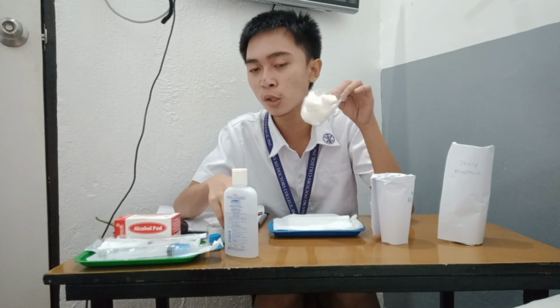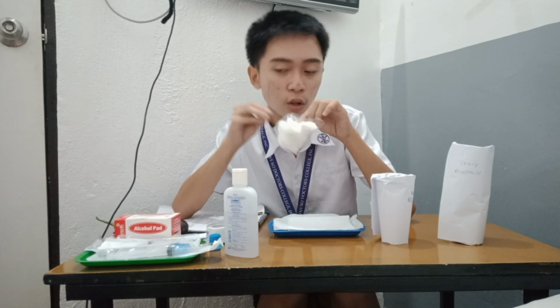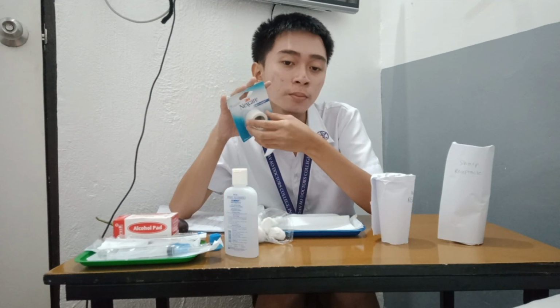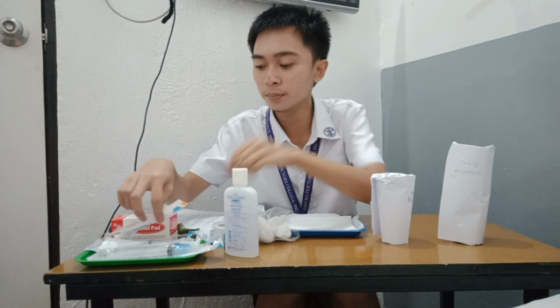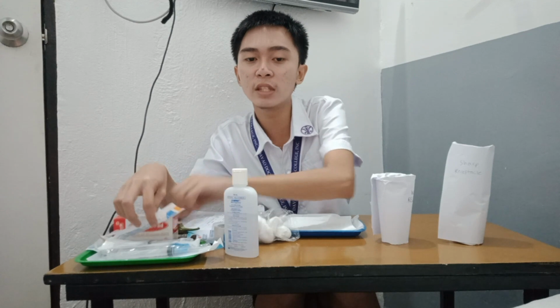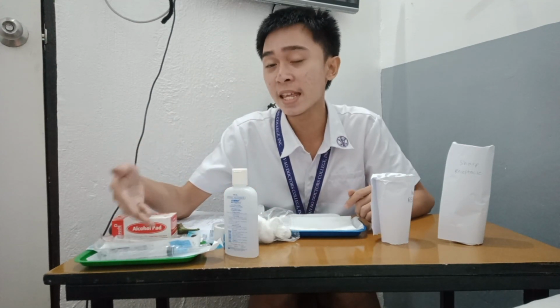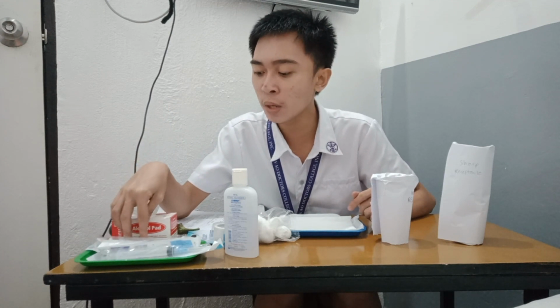Also we have cotton balls which are soaked in alcohol, micropore, a cotton tourniquet, an eggplant to substitute for the actual skin of our patient later, and an aspirating needle. And also we have the 1, 3, 5, and 10 cc syringes, and also we have the ampules.